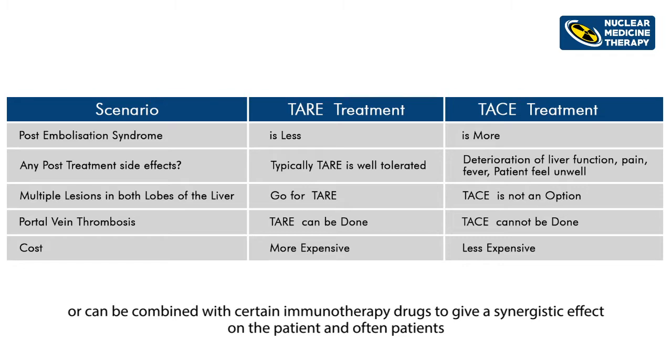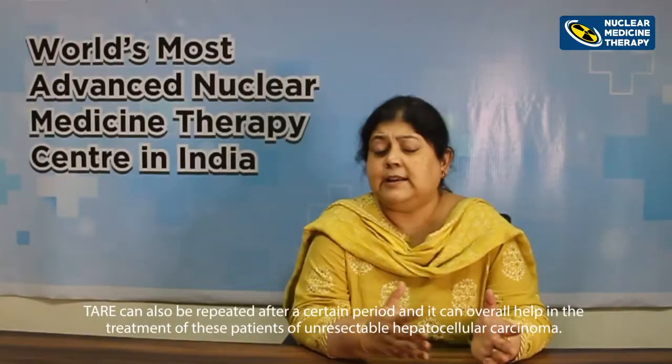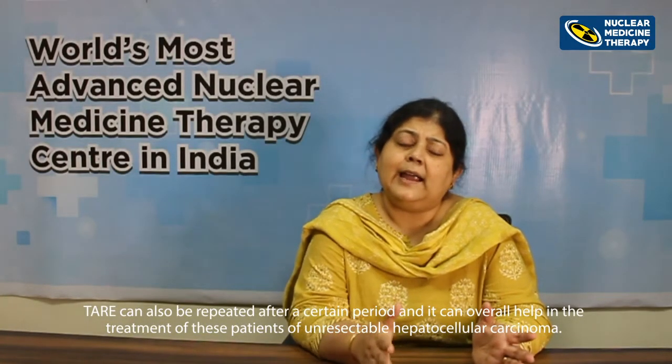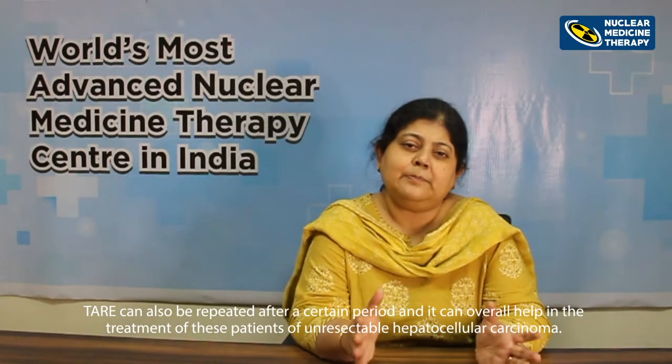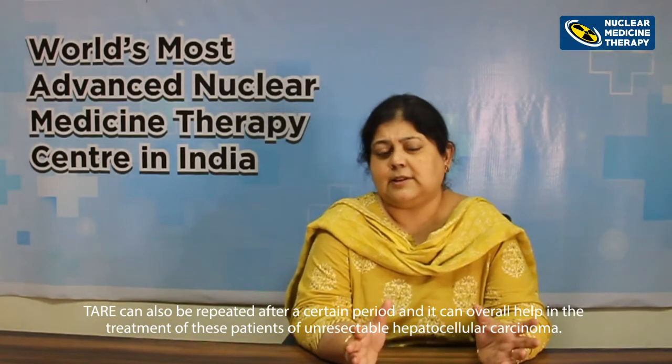Often patients with very large tumors which are not amenable to any other procedure come for TARE, and they have a good progression-free survival post-TARE. TARE can also be repeated after a certain period, and it can overall help in the treatment of these patients with unresectable hepatocellular carcinomas.